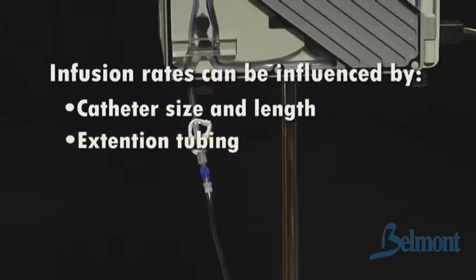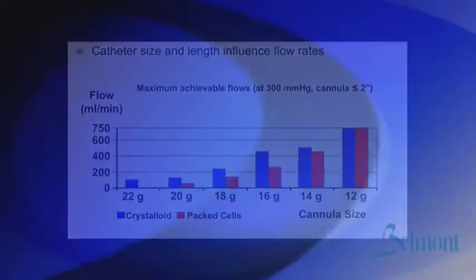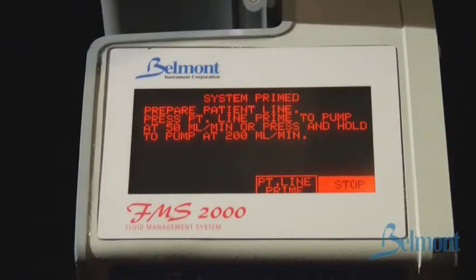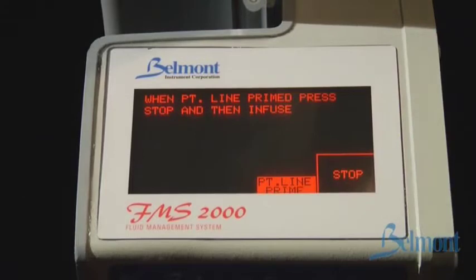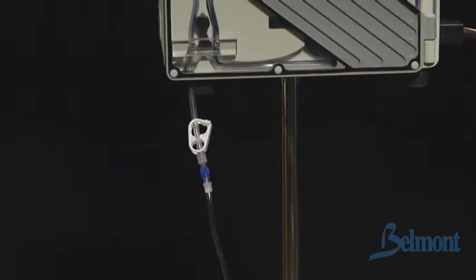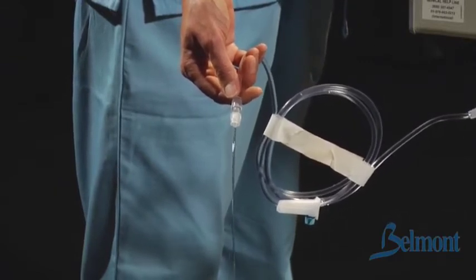Catheter size and length, extension tubing, and stop cocks influence infusion rates. 12 gauge and larger catheters support the Belmont's maximum infusion rate of 750 milliliters per minute. If extension tubing or stop cocks are used, make sure that they can support high flow rates. The next screen prompts you to purge air from the patient line. Press the patient line prime key once to prime at 50 milliliters per minute, or press and hold to prime at 200 milliliters per minute. Press stop after you have confirmed all air has been purged from the patient line. The system automatically enters a standby mode until you are ready to connect to the patient's catheter. Before continuing, please inspect and make certain that the patient line is completely primed and free of air. Any air bubbles after the patient safety valve wand must be removed before the procedure can safely continue.